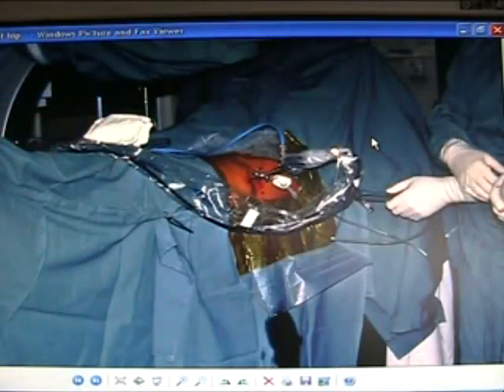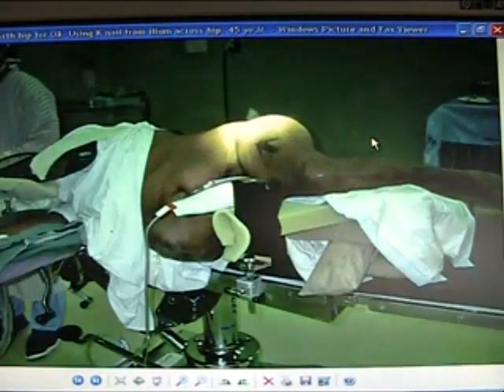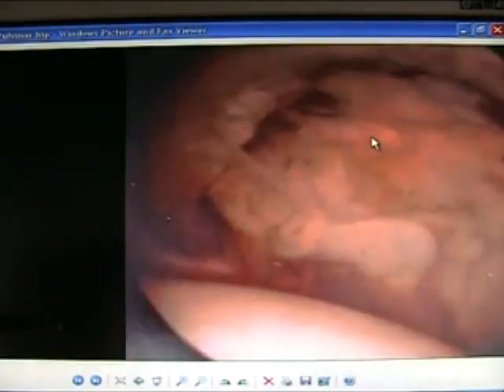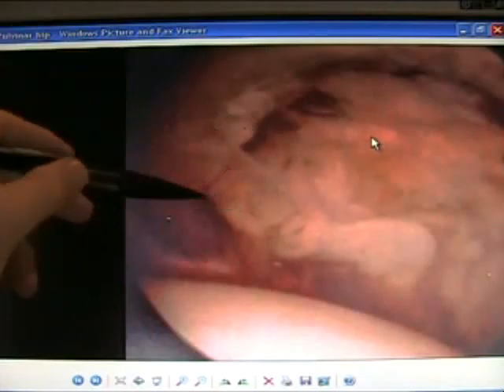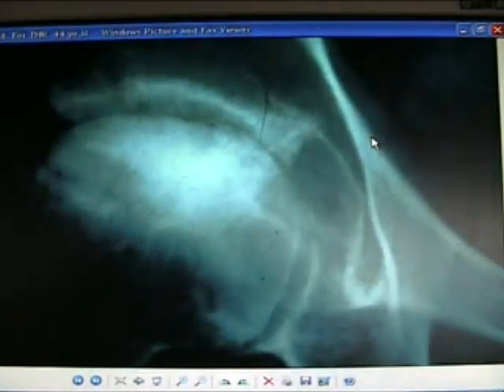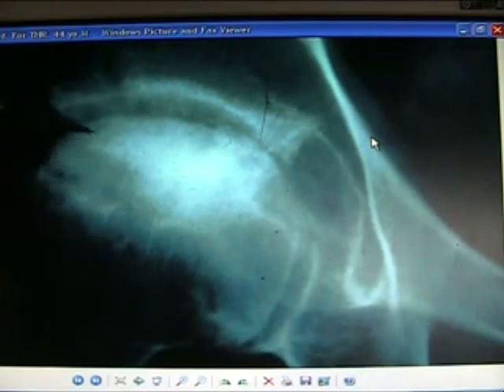Arthroscopy of the hip is difficult to do and not commonly done. Here's a view of synovitis at arthroscopy of the hip. AVN is common in the hip.